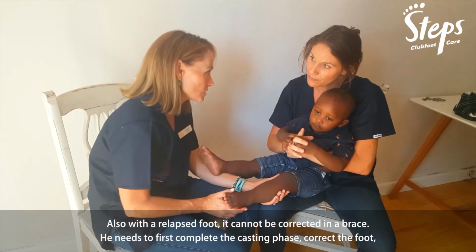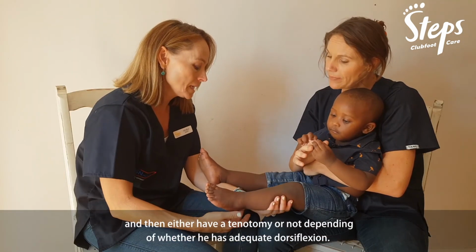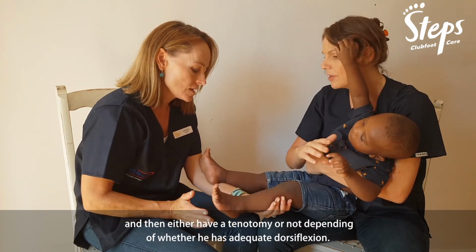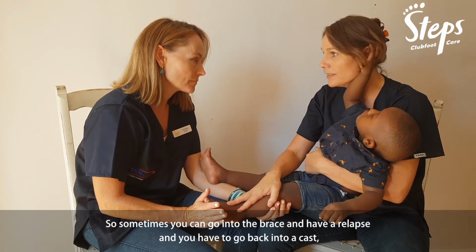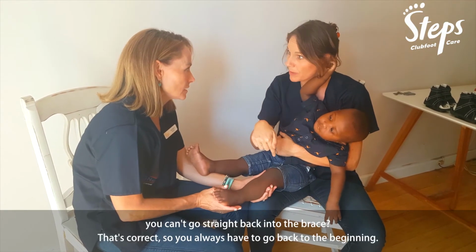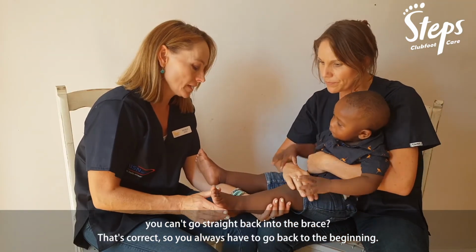He needs to first complete the casting phase, correct the foot, and then either have a tenotomy or not, depending on if he has adequate dorsiflexion. So sometimes you can go into the brace, have a relapse, then you have to go back into cast. You can't go straight back into the brace. Is that what you're saying? That's correct. Okay. So you've always got to go back to the beginning.